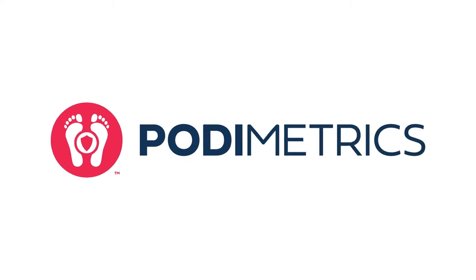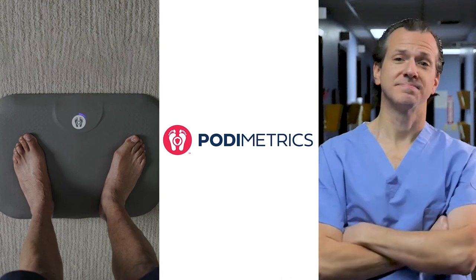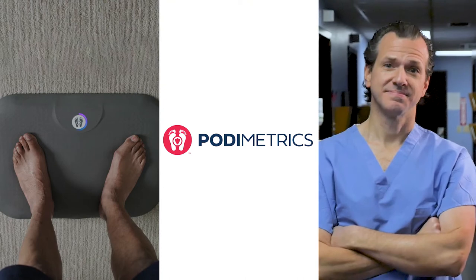Welcome to Podimetrics. We are happy to help you step into a new day with the Podimetrics SmartMat. Your new SmartMat, Podimetrics, and your doctor all work together to help you avoid foot complications. Let's get started.